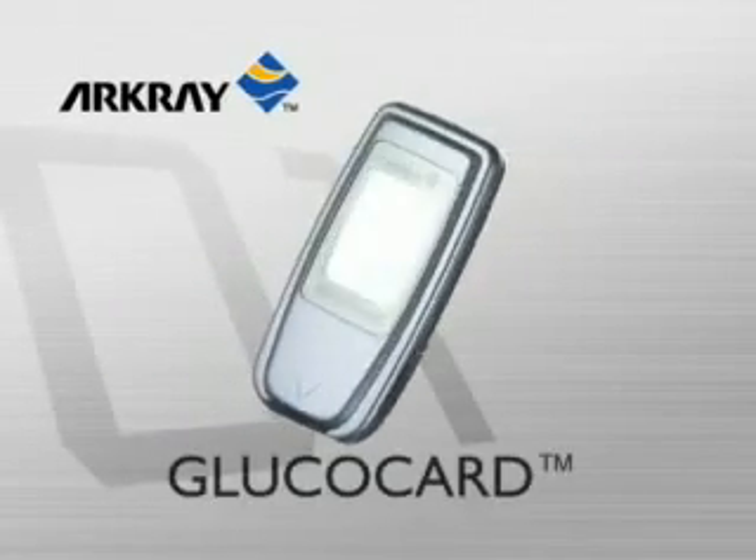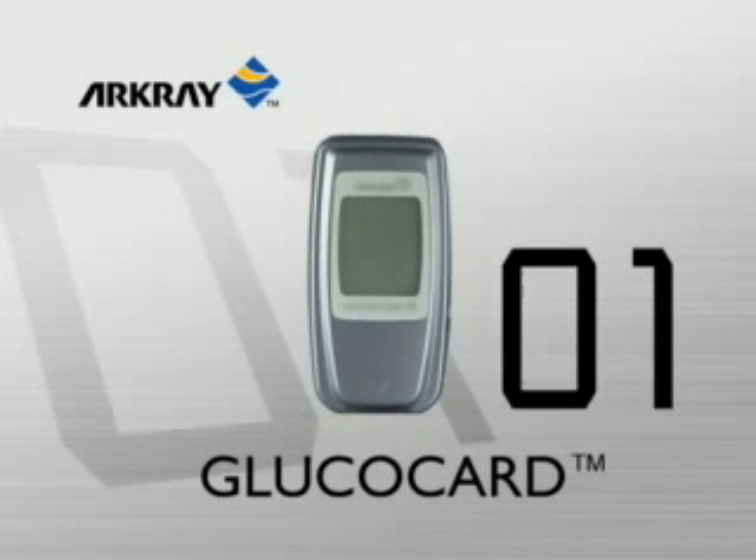Glucocard 01 offers superior functionality in a palm-sized blood glucose meter.